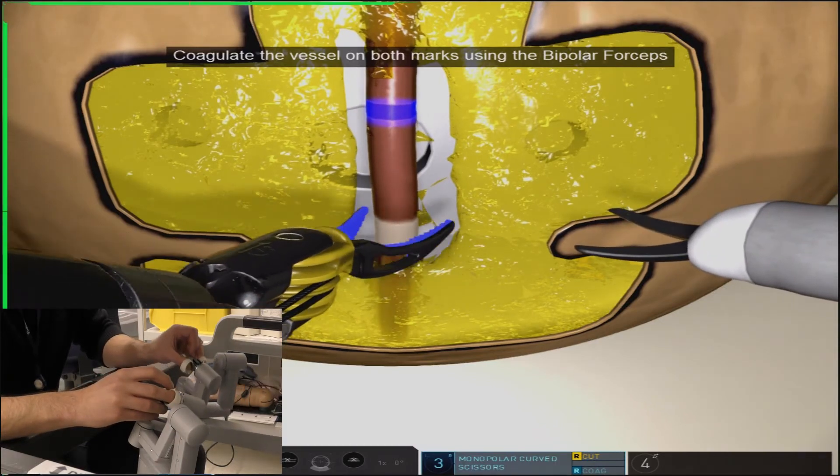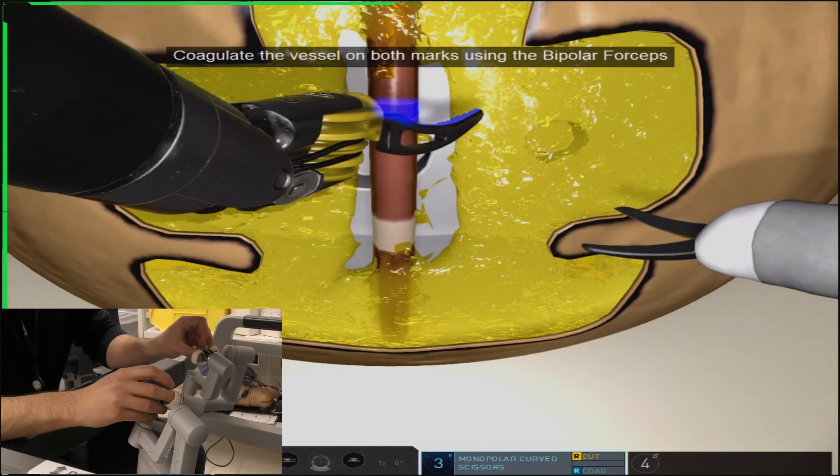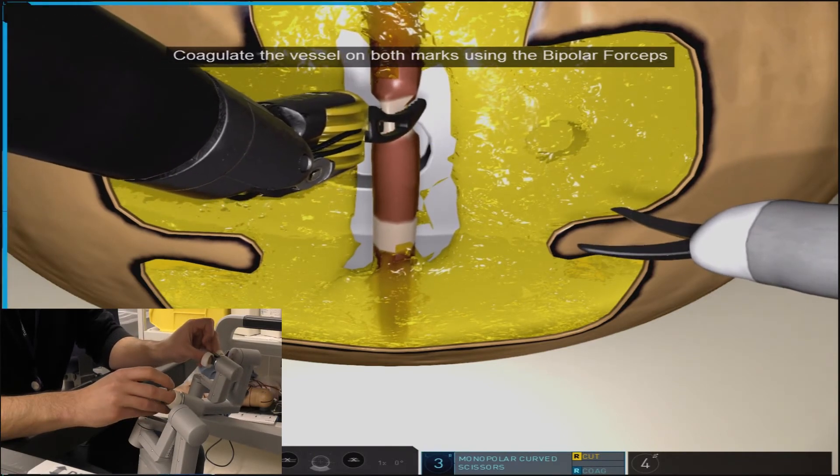Simply grab the vessel at the two indicated points and perform coagulation until you see that portion of the vessel turn white.